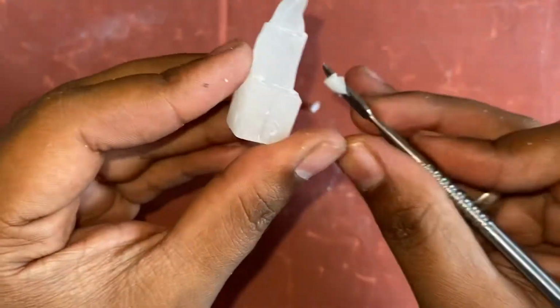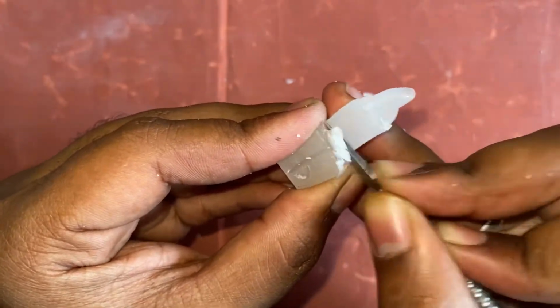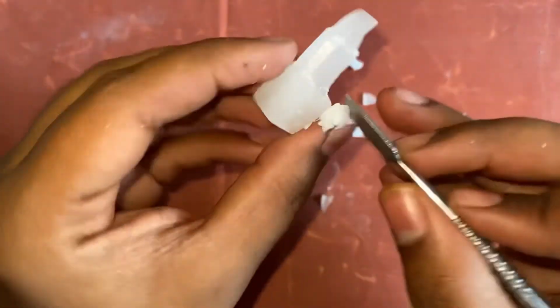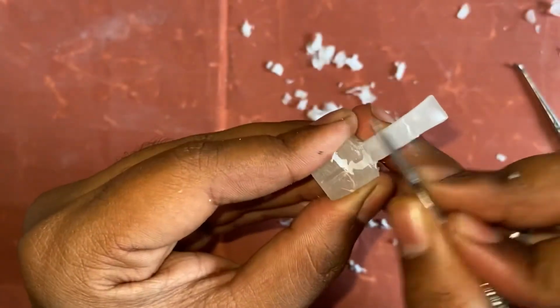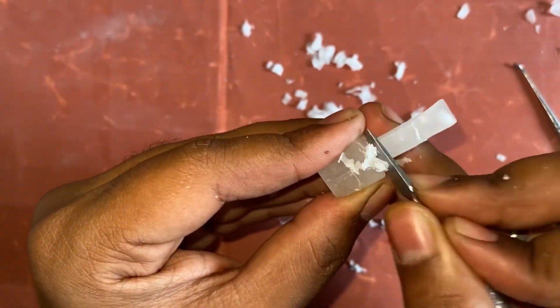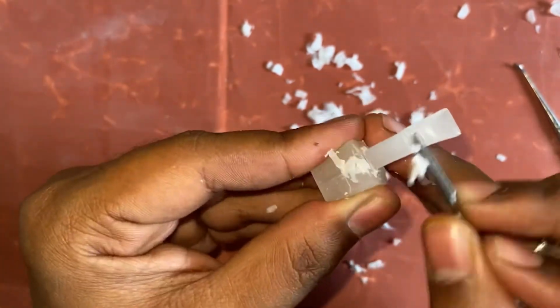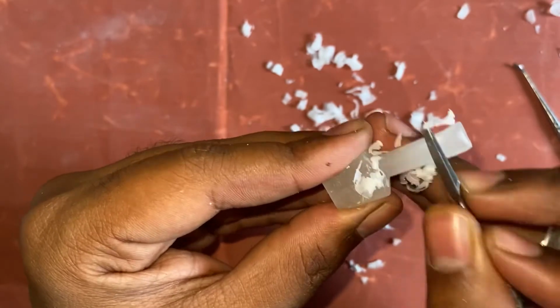Now scrape out the wax from all the sides, from all the aspects of the root portion. For the carving of the root, you have to keep in mind that the tapering of the root should be present, and the tapering should be towards the apical portion of the root.